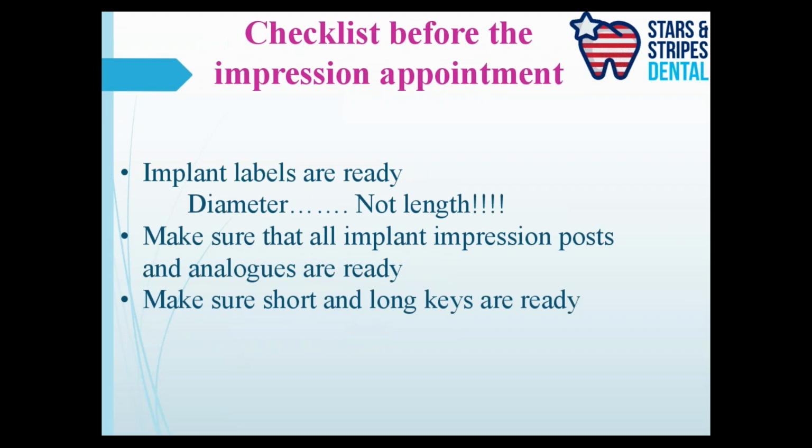Okay, this is the small checklist. Before you schedule your patient for making an impression, you have to make sure you have the right kind of impression material, the trays, and also the parts. Never do such hasty work as the patient just walks in, or you just call the patient without being prepared, because you don't want to be scrambling around and calling your friends or colleagues or implant reps for giving you the parts that you need, because that increases your anxiety, especially when you're doing it for the first time.